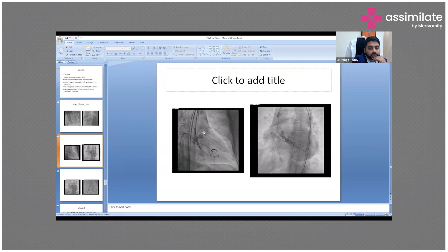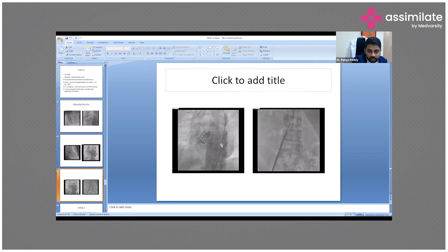We pre-dilate such valves before implanting. On the right side you can see a balloon-expandable valve with three markers — I'll show you after expansion. After pre-dilation, we place the valve and align it using the markers. We then expand it with the balloon and inflator from outside.